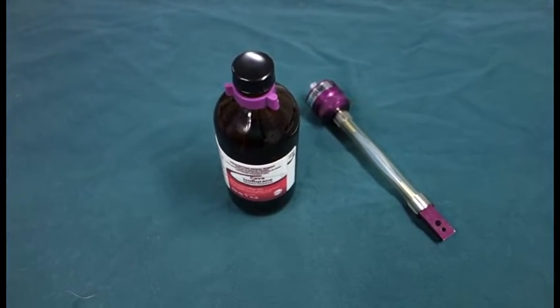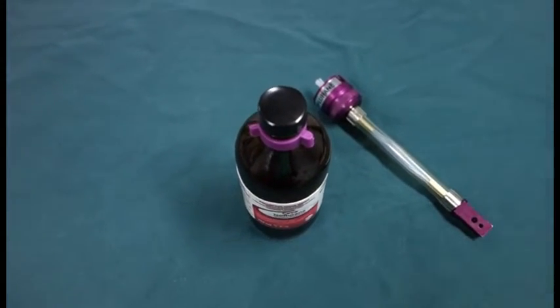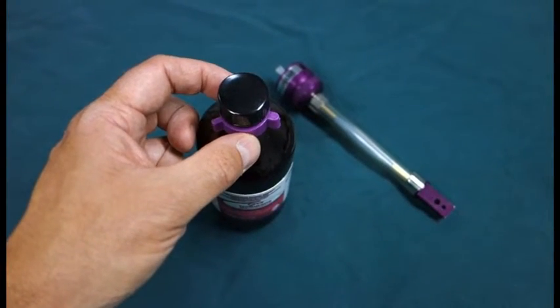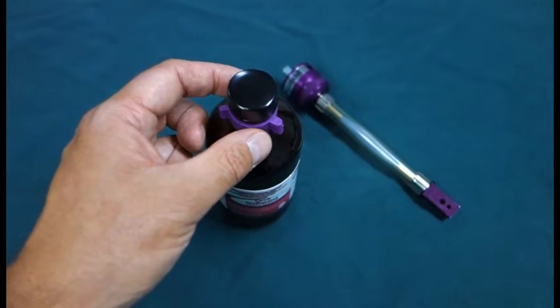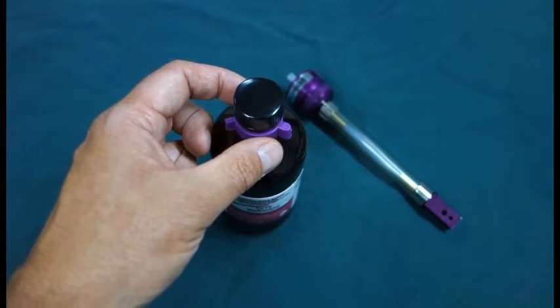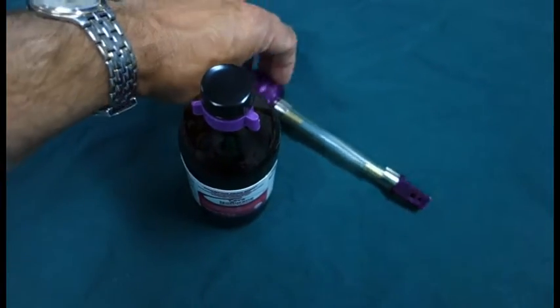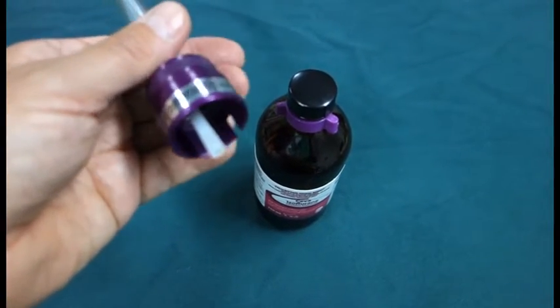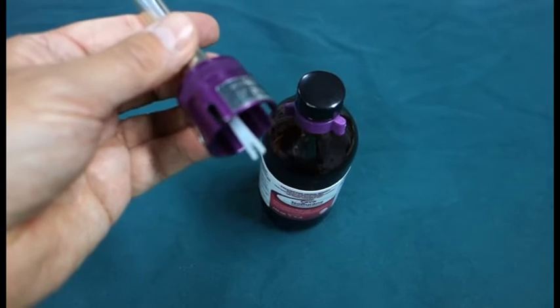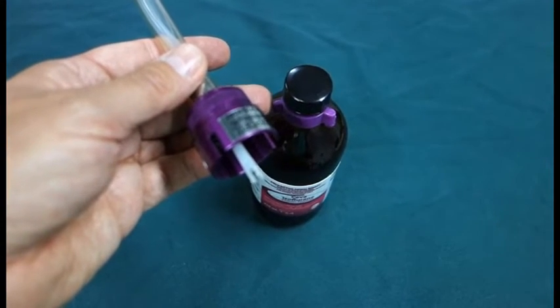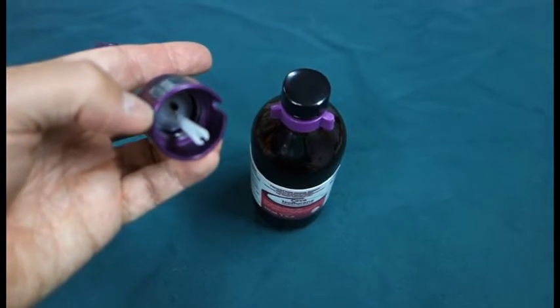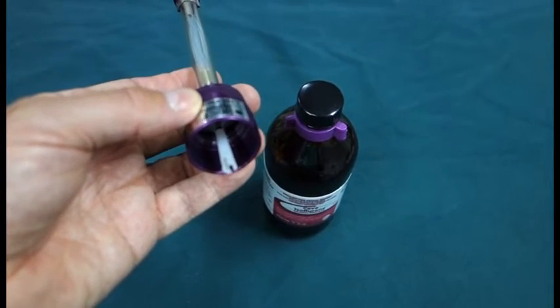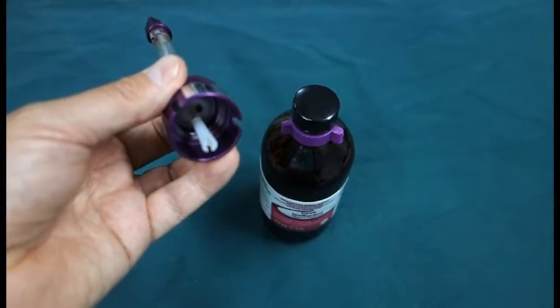You'll notice first of all that the bottle of isoflurane has a purple keyed filling system. Each type of anesthetic agent will have a different selection of nobbles on the top of it, and those nobbles correspond with a specific filler. This is an isoflurane filler, so you'll find that the nobbles on the top of the bottle will correspond with the pieces that have been cut out of the filler. That's so basically you don't get different types of anesthetic agent mixed together.